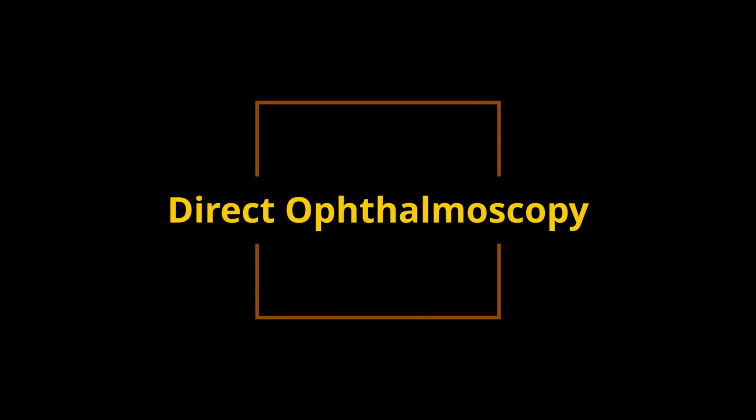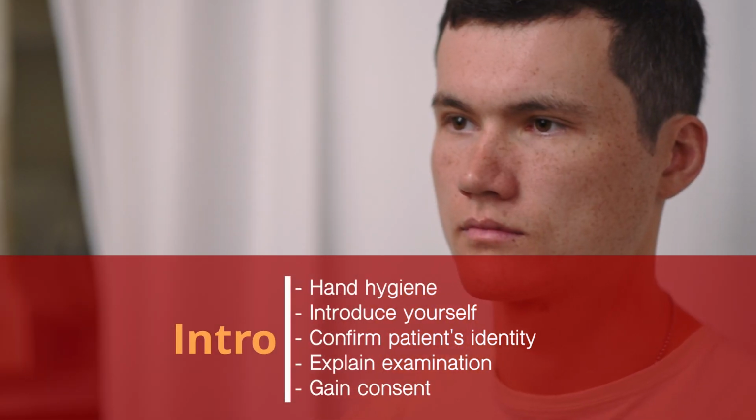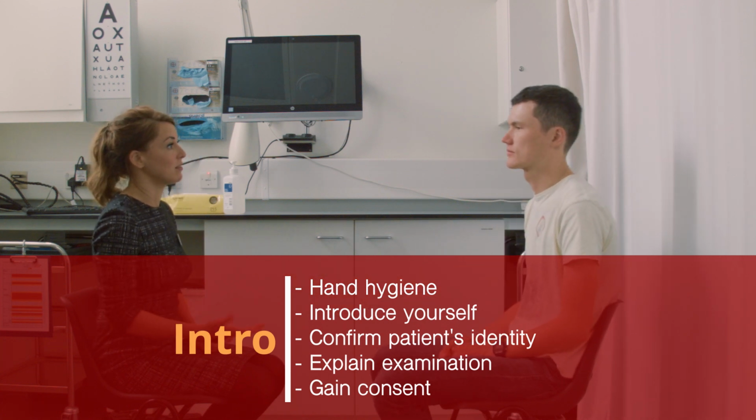This video describes how to perform direct ophthalmoscopy. Start with hand hygiene and introduce yourself. Confirm the patient's identity, then explain the examination and gain consent to perform it.